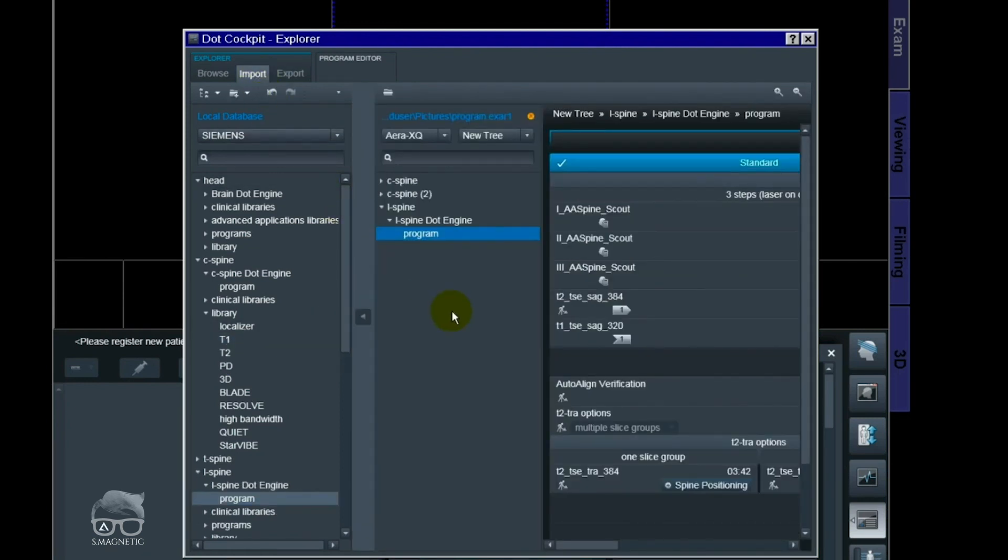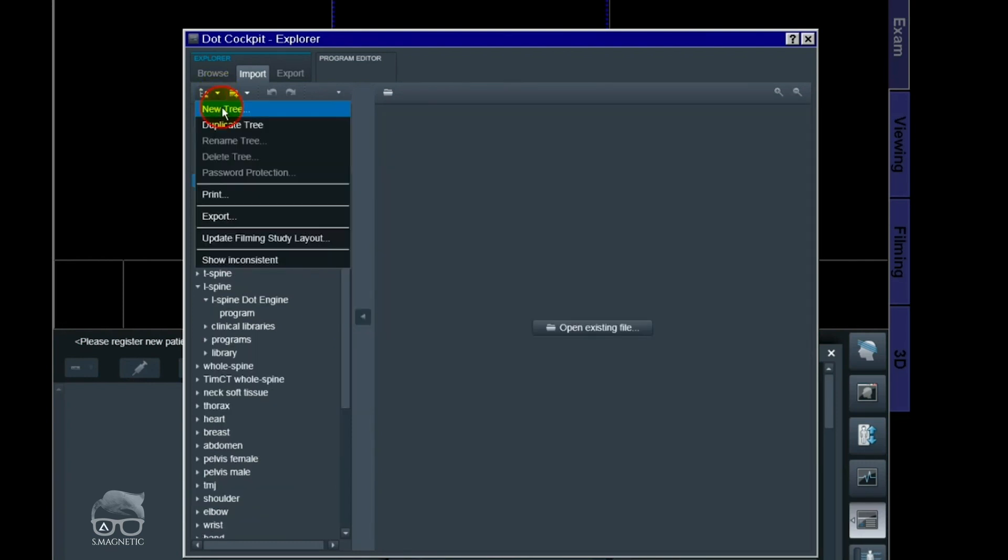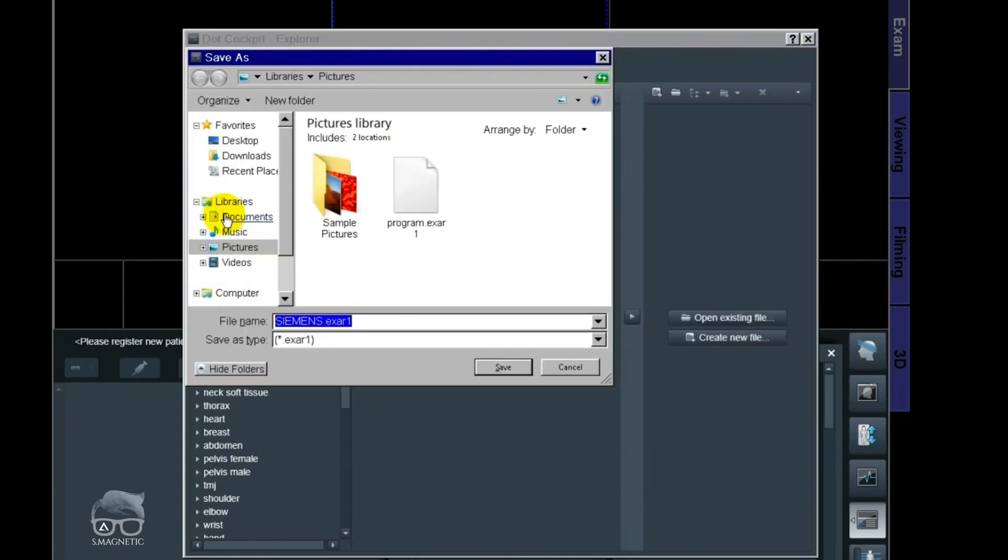So when it comes to import, you just choose the specific file from the USB pen or whatever you got, and just mark it and push that button right there. That's the import button. So if you want to export the whole user tree, you can just go up in there and push the export. And this is of course the Siemens one. I'm not going to export this one, it takes too long, now just going to cancel it.